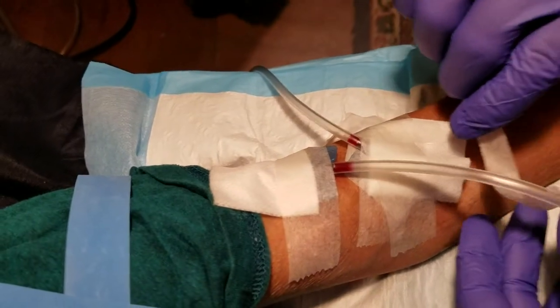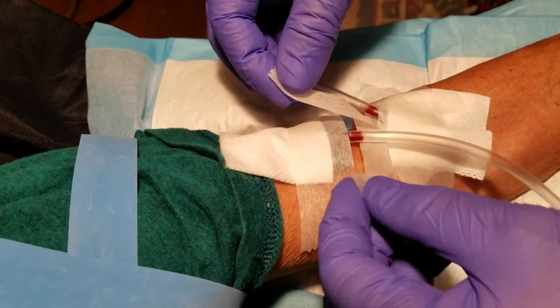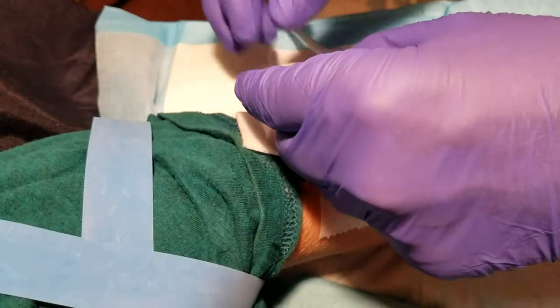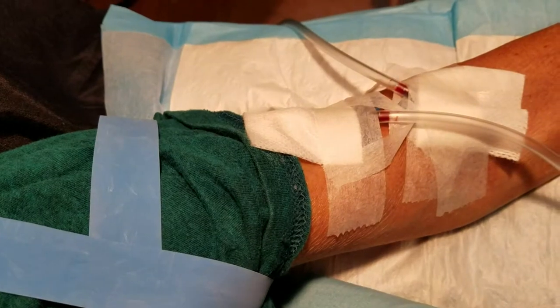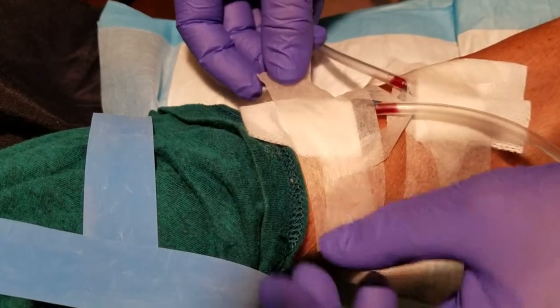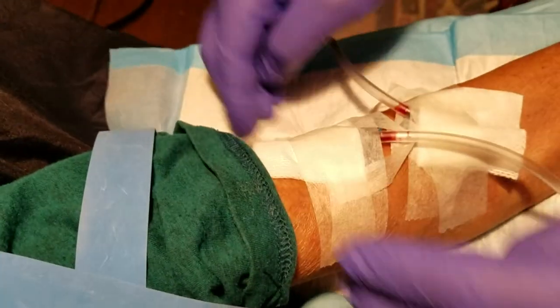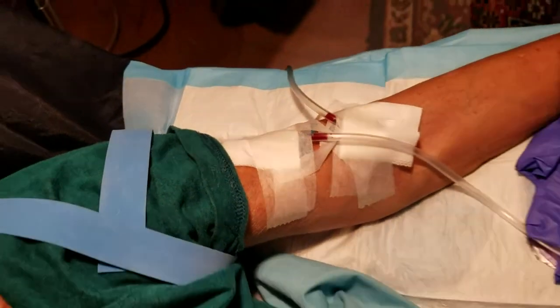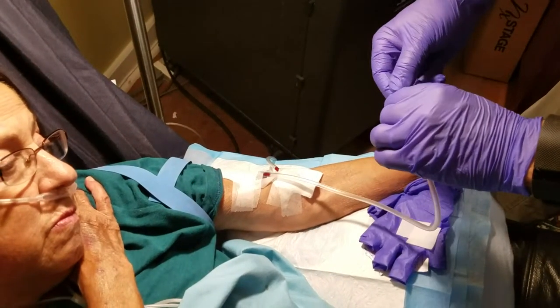I'm gonna put the tape right there. I'm gonna get the chevron — like this, like so. And tape the chevron down with another piece of tape over the top. And there you go. Now we've made our connections. Cannulation.